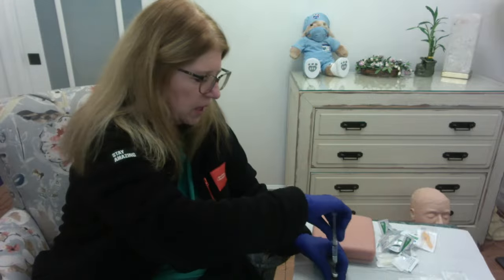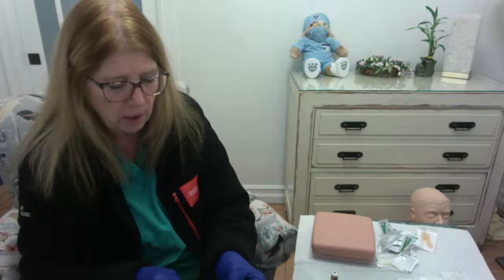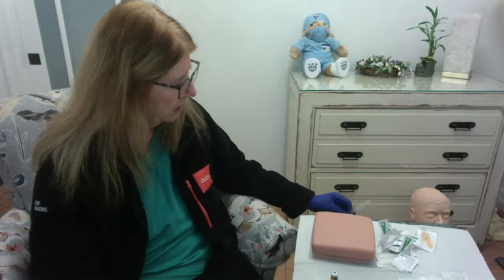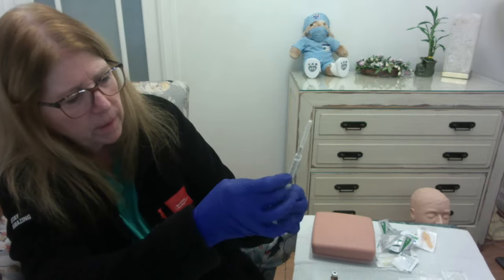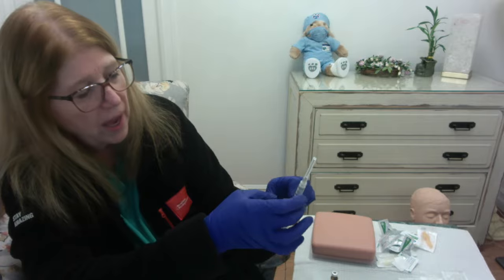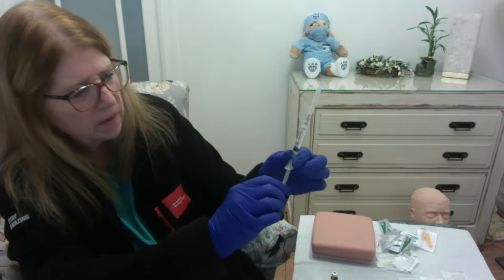So let me take this needle out and let me safely recap this, okay? And let me do a little bang here. See if I can move that air up to the top. If not, I'm going to do the flick, and I'm going to get that air to move to the top, which it has. That bubble down at the bottom has disappeared, but now I have air up at the top.